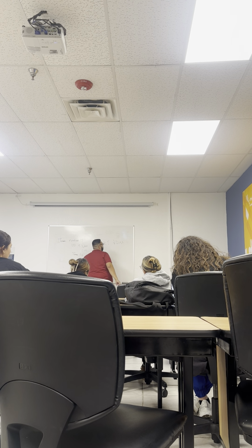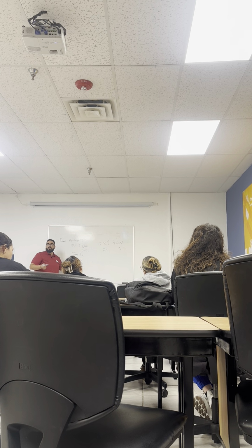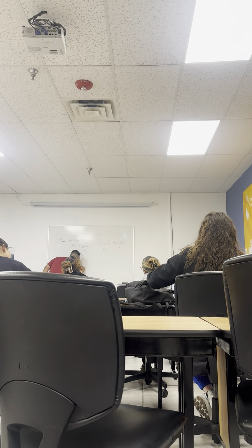So if I halve the distance, what do I do to the frame rate? You multiply it by 2, because we did the inverse to it. Increase it by 2. So if we halve the distance, we double our frequency, which is 20 hertz.